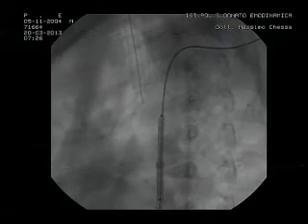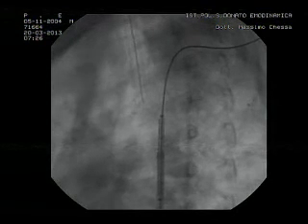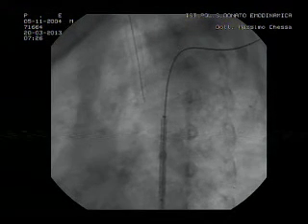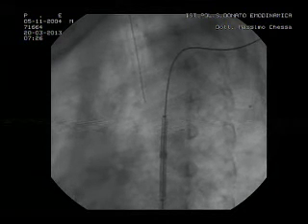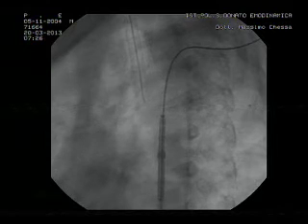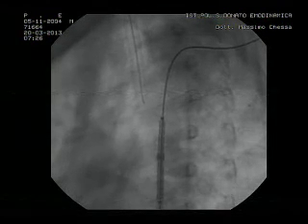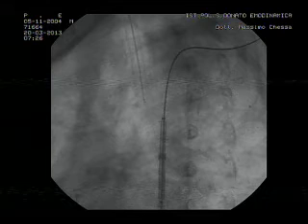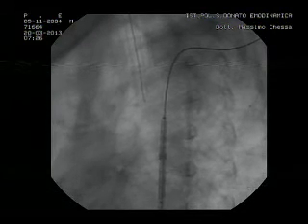I think going for the left subclavian here makes it much more difficult to do this case. So if you are staying where you are, then as the stent starts to push down, push it up as you will come down below. Okay, it's a good suggestion. Actually, I have the habit to leave it because it gives me more indication about the exit position of the stent. It doesn't give me any curve on the stent when I inflate it.